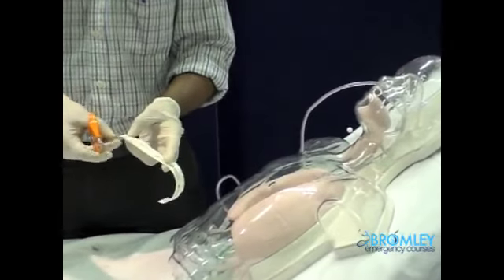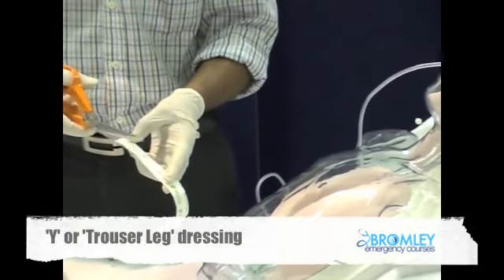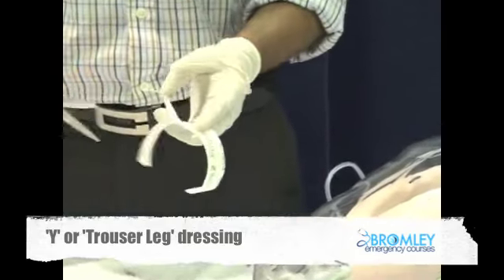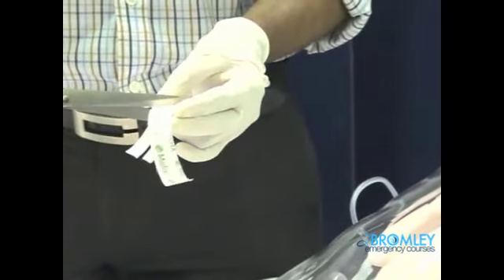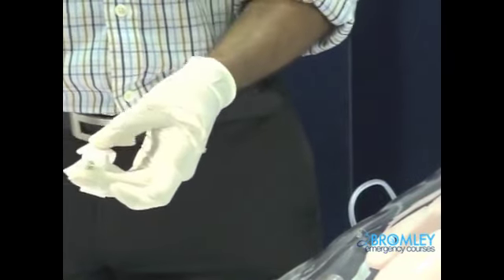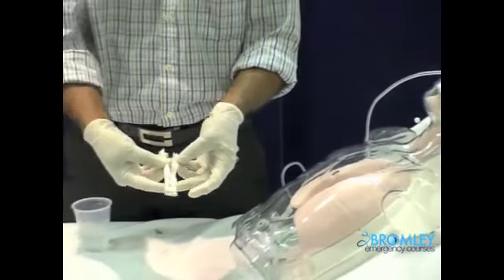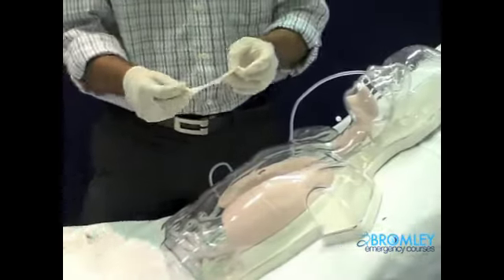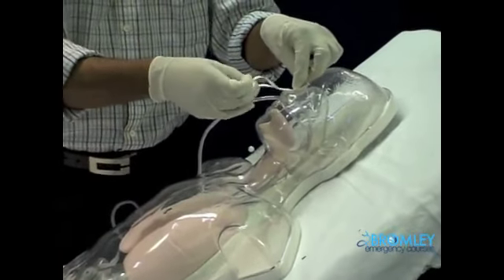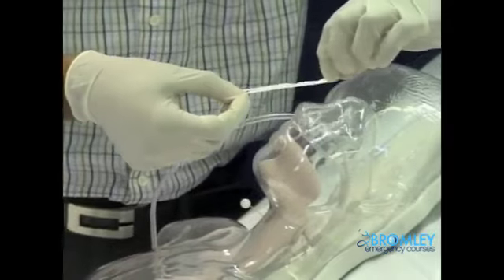Cut it as in Y. So you've got a Y. So the top end goes to fix to the nose. The other two ends will crisscross to fix to the NG tube, so that it holds well there.